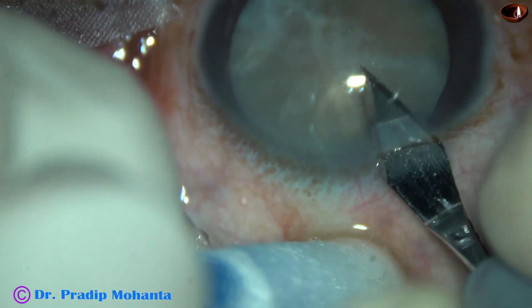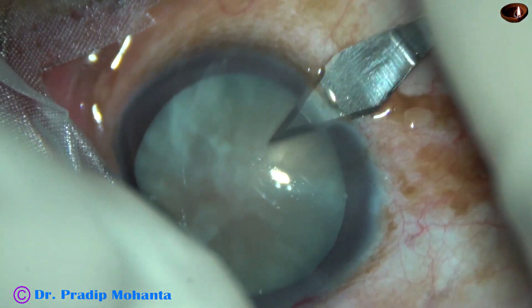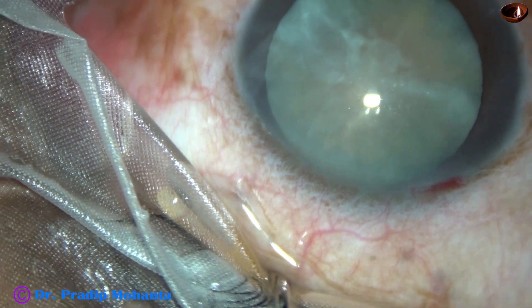This is the main incision with a 2.8 mm steel keratome on the posterior aspect of the limbus. This is a side port on the right side of the main incision.